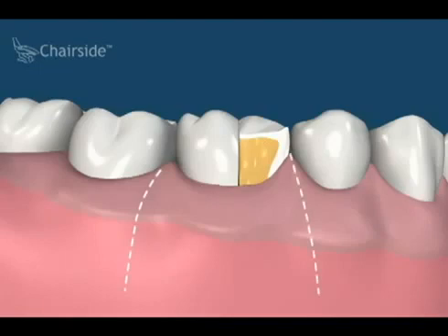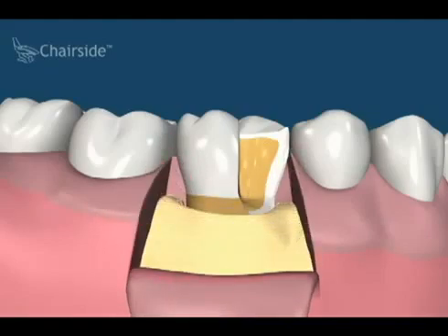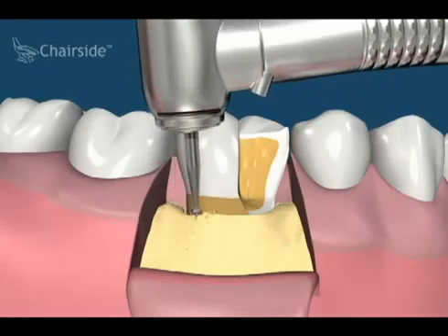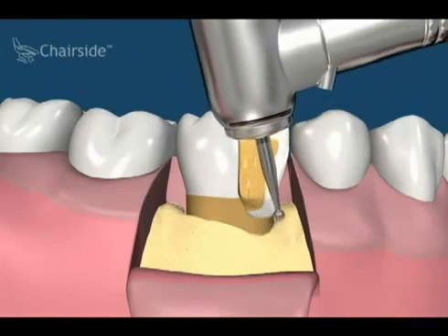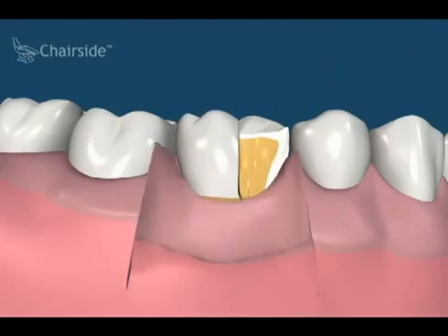First, we raise a gingival flap for access, and then we reduce the bone level so that the bone is a certain minimum distance below the fracture. Different instruments, including the dentist's drill, are used to reduce the bone height, and this new bone architecture is prepared to support the gums in a lower position on the root of the tooth.